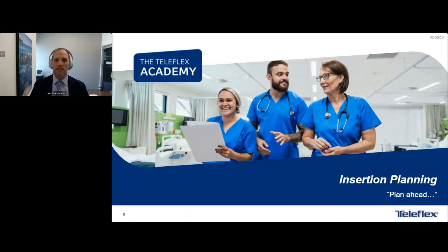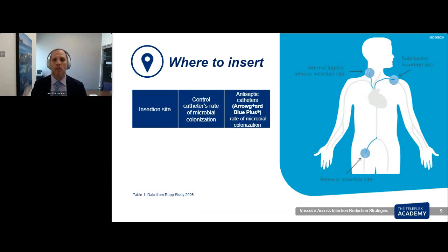So insertion planning, how do we plan ahead? You have to think about your insertion site. The typical insertion sites used are the internal jugular, subclavian, and the femoral veins.